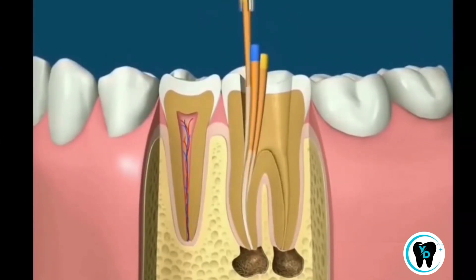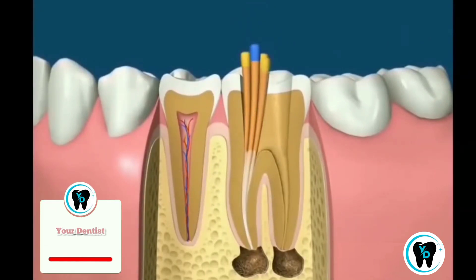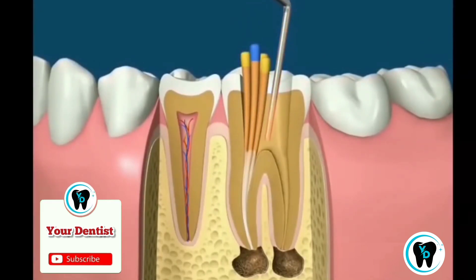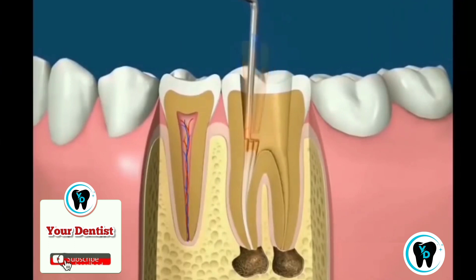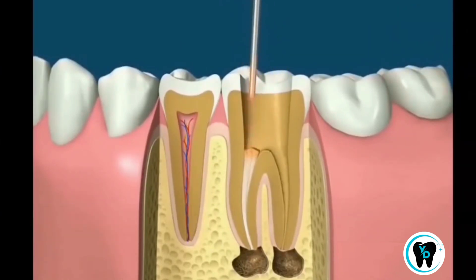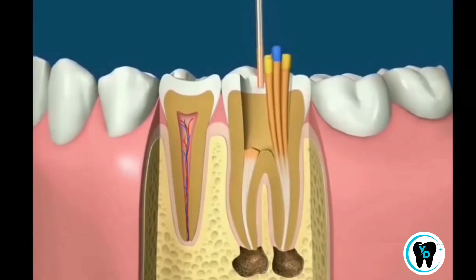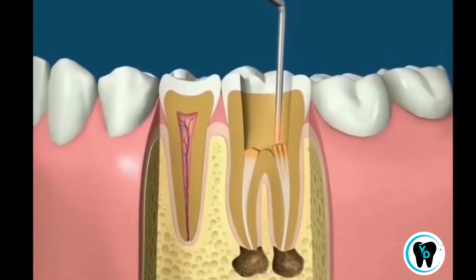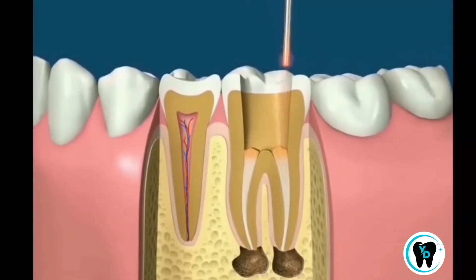After the canal is tightly sealed, the excess rubber cones can be removed with a heated instrument. The heated instrument can also be used to heat and compact the cones to better fill the canal space. For optimum treatment, one or more posts may be placed.